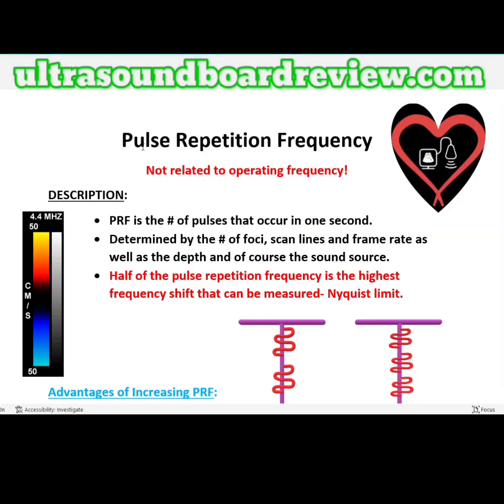Today we're going to talk about pulse repetition frequency because a lot of people are getting a lot of questions about PRF on their SPI boards. First off, you're going to have to know that PRF has no relation to operating frequency. They are completely separate. PRF is defined as the number of pulses that occur in 1 second.